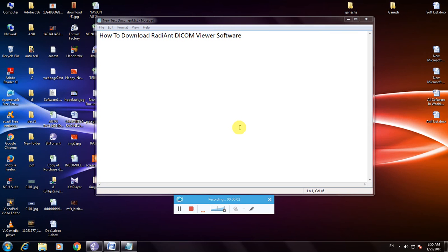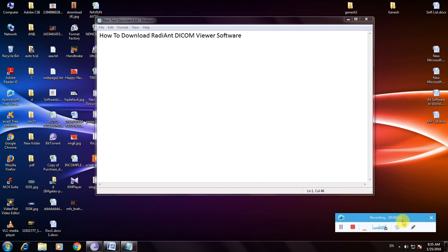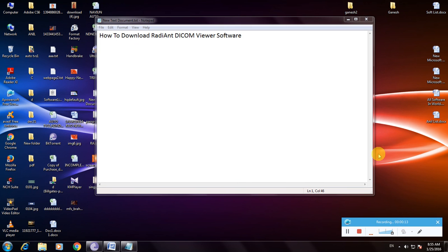Hi friends, now I'm showing how to download RadiAnt DICOM Viewer software. Many people don't know about this software. This is the best software to view medical images, so I'm showing how to download it in a simple way.